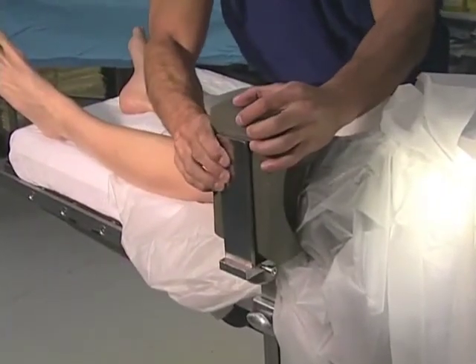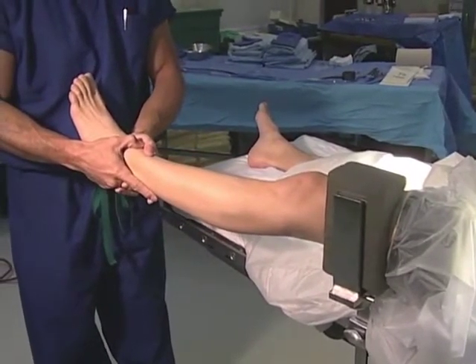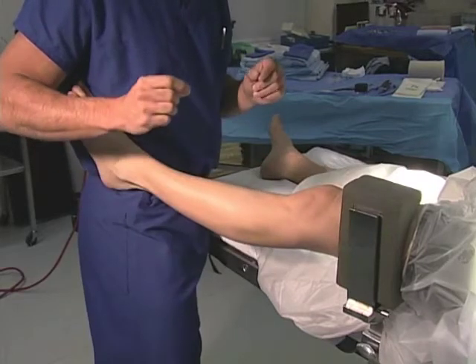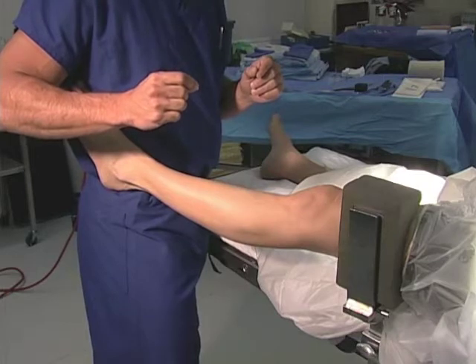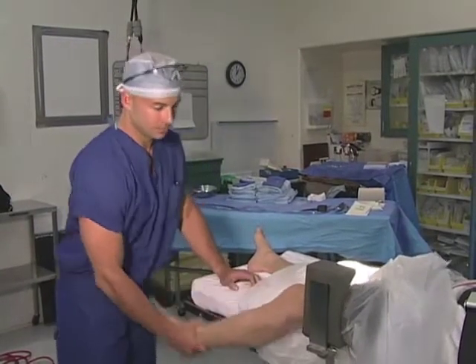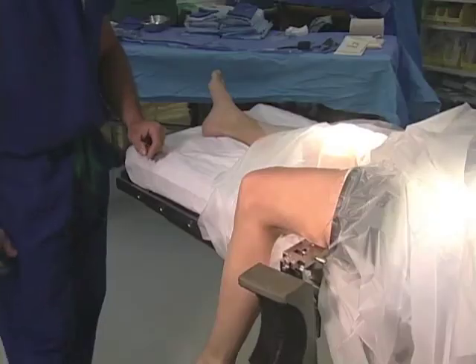The post allows the surgeon or assistant to grasp the foot and push it into valgus or laterally to expose the medial compartment. If a surgeon is working without an assistant, he can place the leg on his hip and use his hip to push the leg laterally or into valgus while using his hands to operate the camera and instruments in the medial compartment. After medial compartment arthroscopy is completed, the surgeon bends the knee off the end of the table and the post may be lowered.